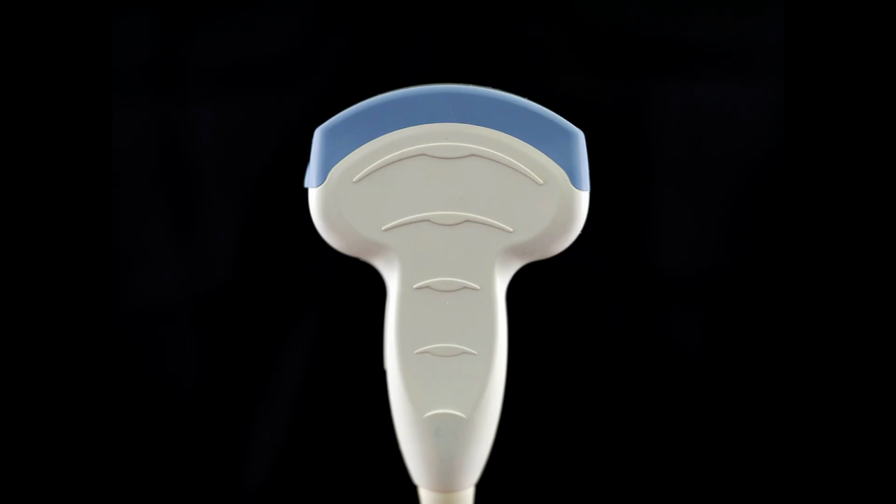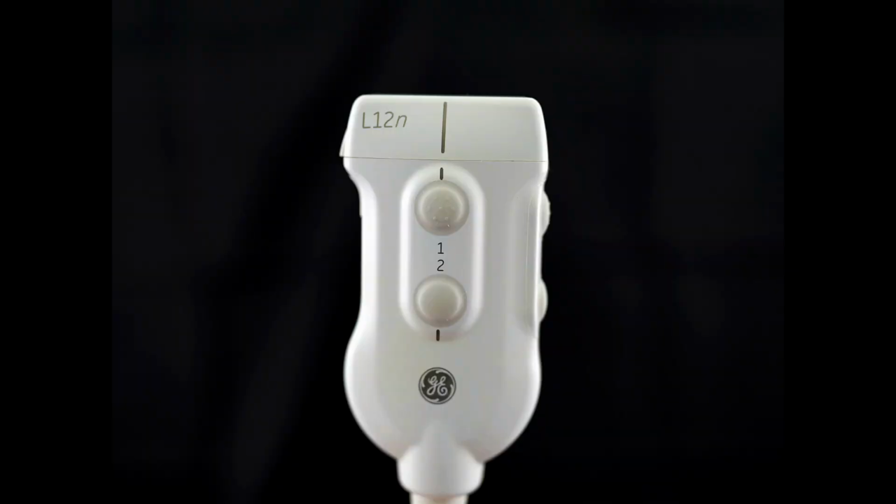But you can actually use a transcutaneous transducer. So you can use the curvilinear or the phased array or the linear transducer to do the same thing, and it's called the telescopic approach. You basically just put the transducer under the angle of the mandible, and you can get a pretty good picture.